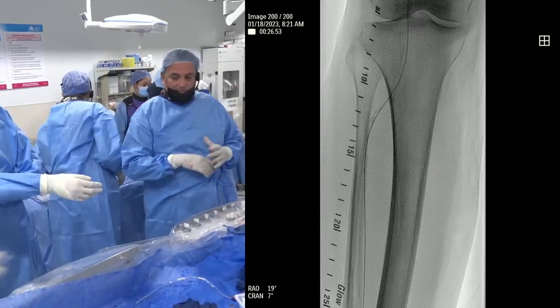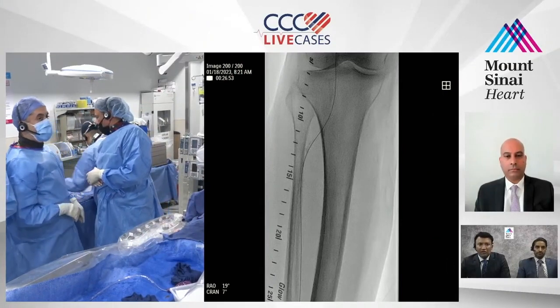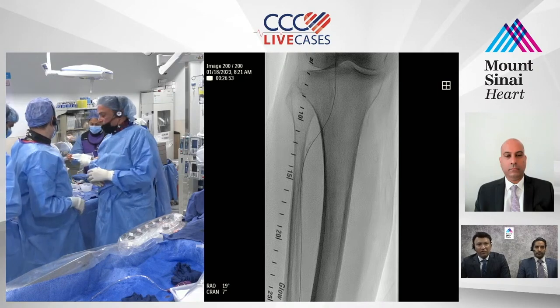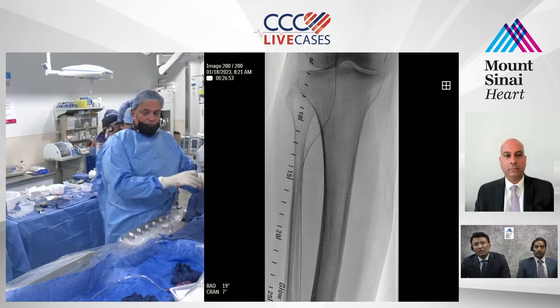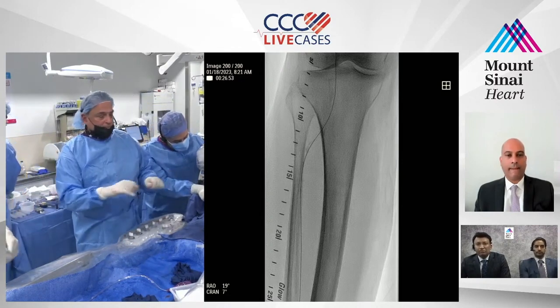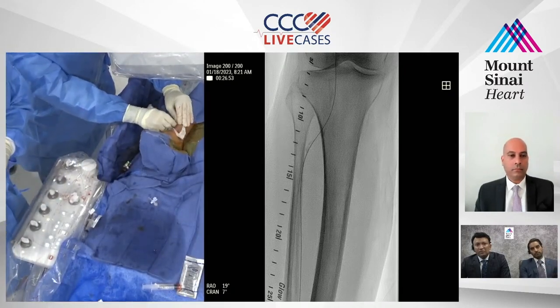PK, question. We didn't cross across the graft, right? We didn't come across the graft with the catheter, up and over? No, we didn't. Okay. Are we able to fill the distal vessel at all? Yeah, you saw the angiogram. It was very poorly filled. So I think right now we're just going to go with a Navicross. We need to cross this.